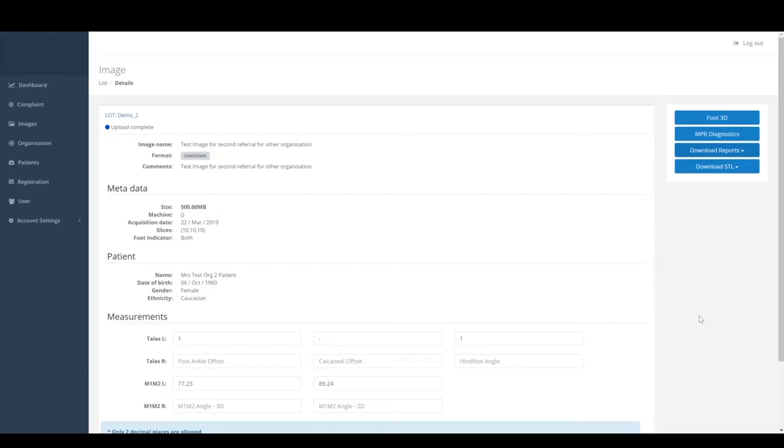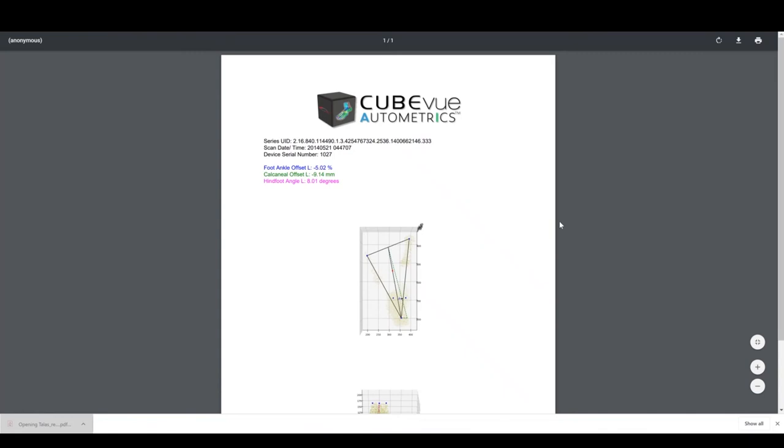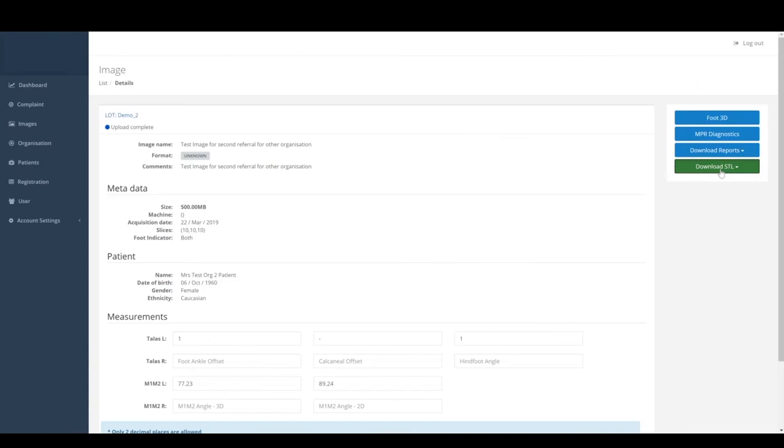PDF reports of the snapshot measurements will be available for download. Download STL files, which can be used with third-party software or for 3D printing.